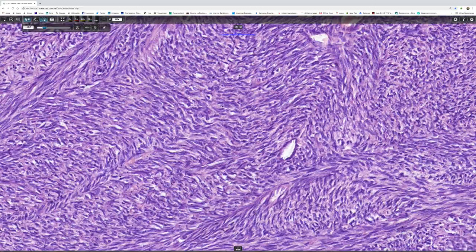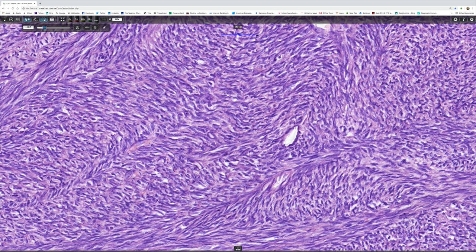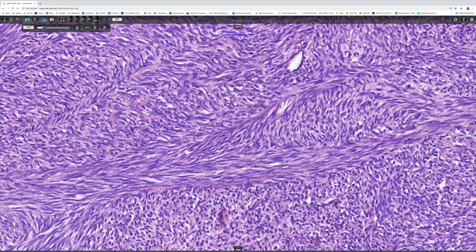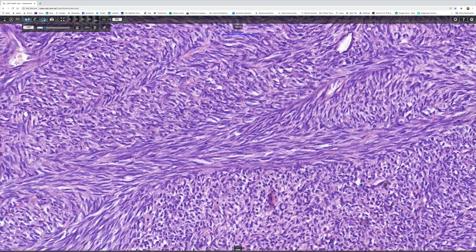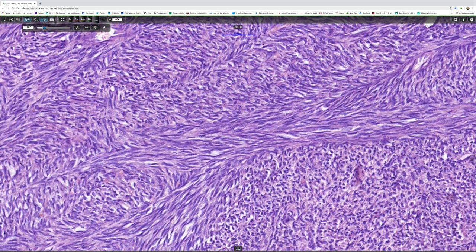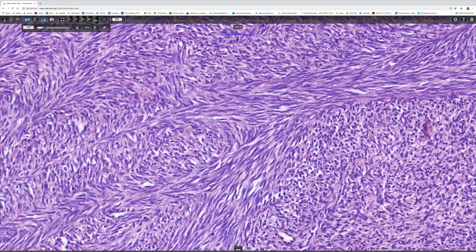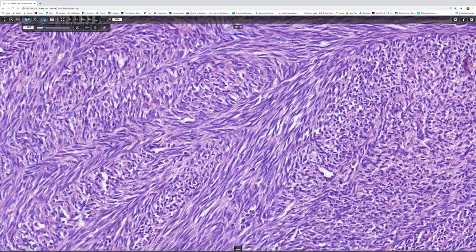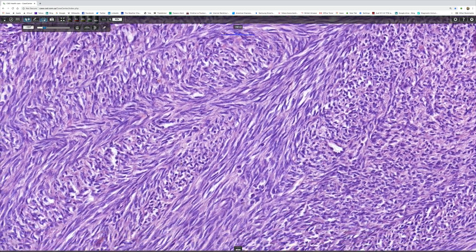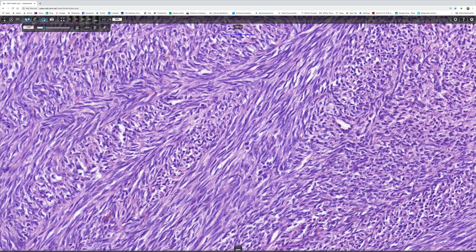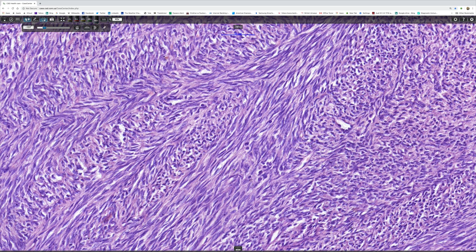This tumor has got lots of mitoses, but the problem I find when you're looking at a scan slide—there's one there thankfully—it's always very difficult to find mitotic figures.